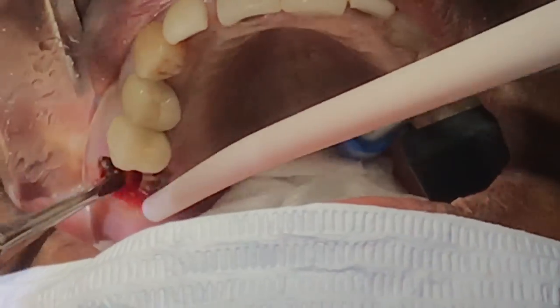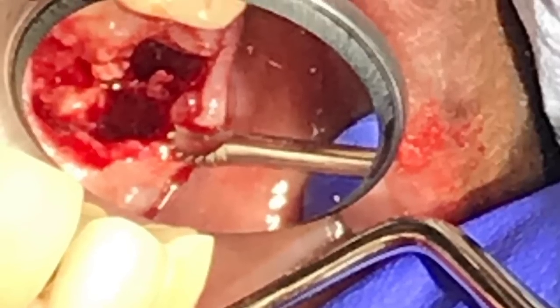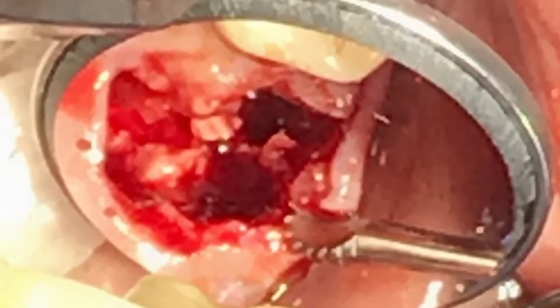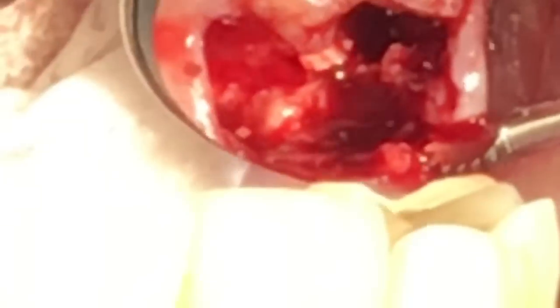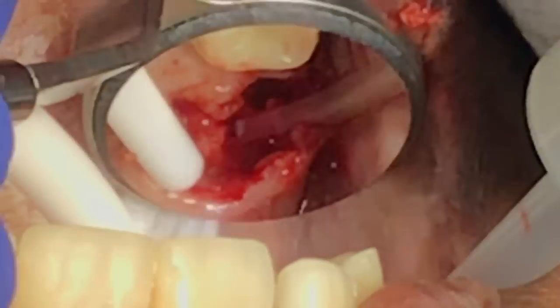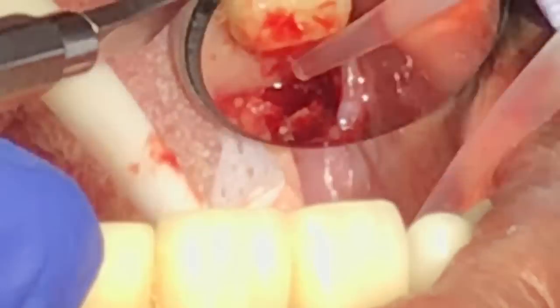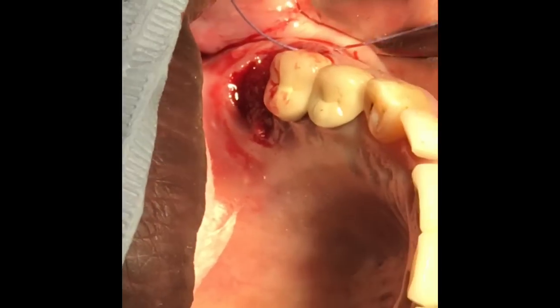The last step is to simply use the straight elevator and elevate each root out. You can see there are three sockets, but there are four pieces of roots that come out. Make sure you double-check there are no broken roots. Start to degranulate the socket, make sure you have a nice clean socket area, and continue to irrigate with saline. Then you are ready to pack Gelfoam or any hemostatic component to stop the bleeding and suture up the patient.